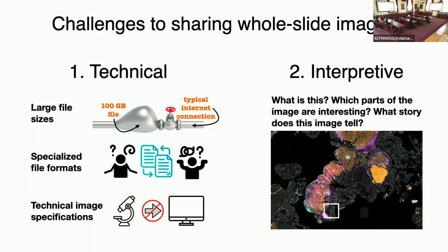Just holding those files is also going to be challenging. The other one is these microscopy images tend to be in specialized file formats, even if they're open file formats like OME-TIFF, which we love. Still not something that somebody has software on their desktop that they can just double click and open.